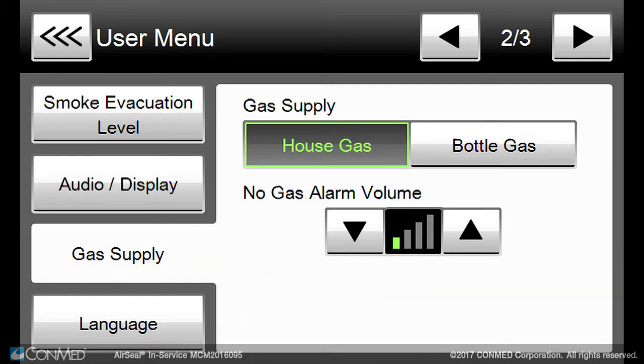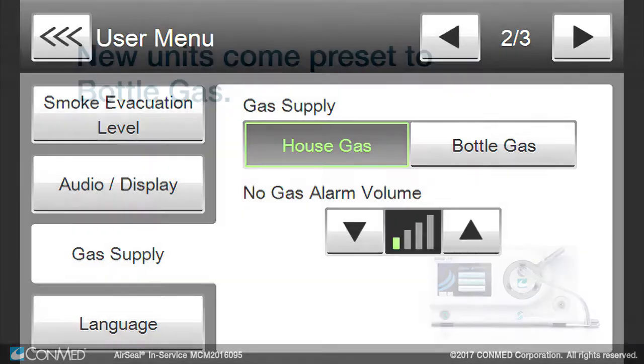You can set the IFS unit for either house CO2 gas or bottle CO2 gas, and you can select the no gas alarm volume.